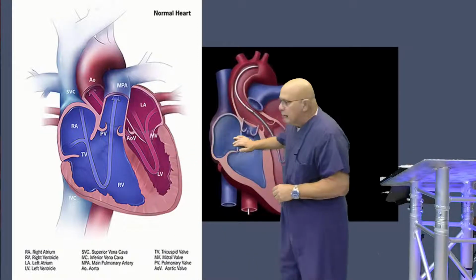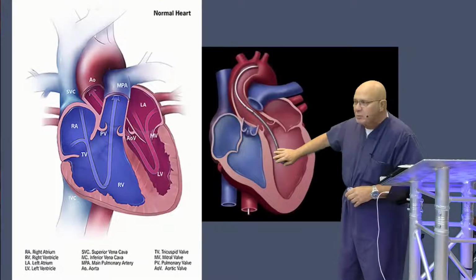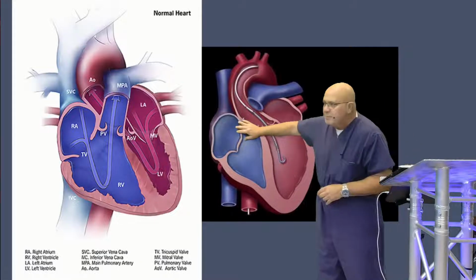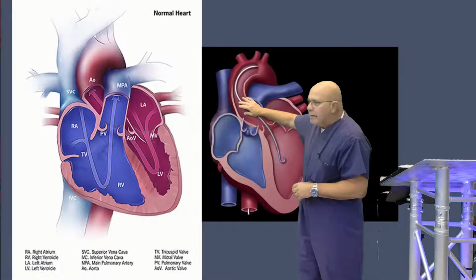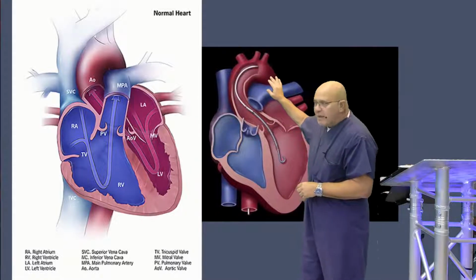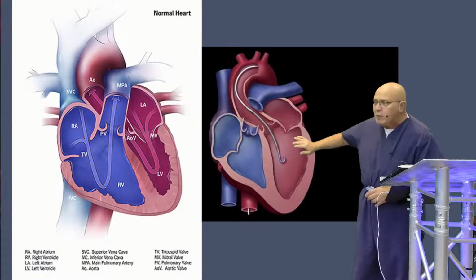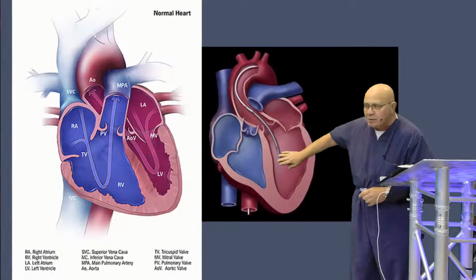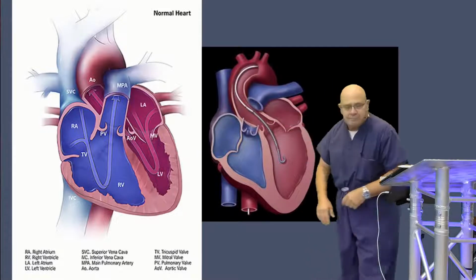The Impella basically is going to do the exact same thing. Even if this heart is not functioning well, whatever the flow is from this Impella is going to be ejected out into the aorta and pumped through the rest of the body. It's going to get as far as it can. And that's what's important here: whatever the blood gases are, the PO2, the saturation in this chamber is what it is going to be here with the Impella.